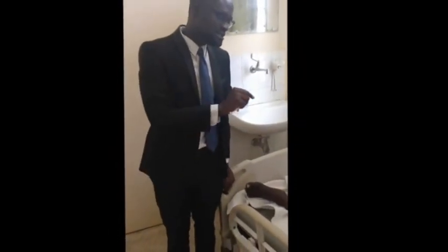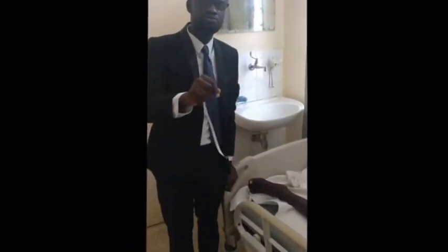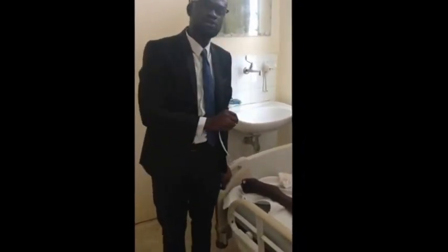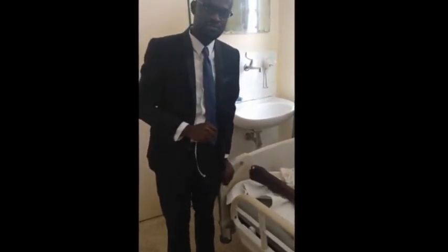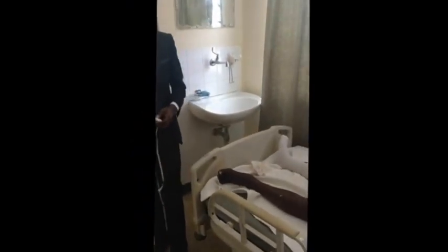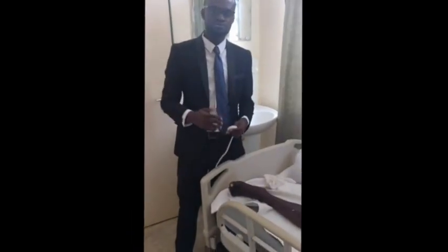So I'll state the calf circumference and the length on the prescription, so that the pharmacist will be able to prescribe the appropriate size of stockings for the left lower limb, and then I do the same for the right lower limb. After I've measured, the patient has gone, or the carer has gone, and brought the stockings.